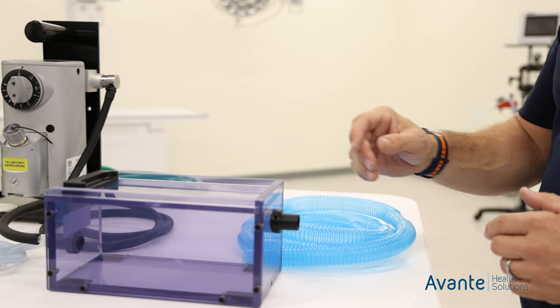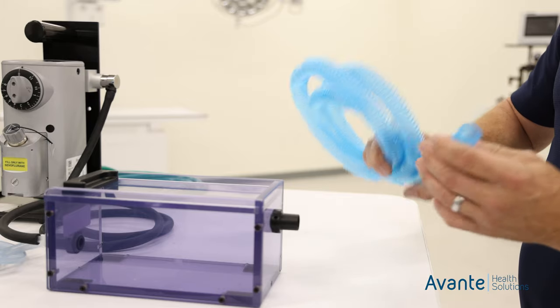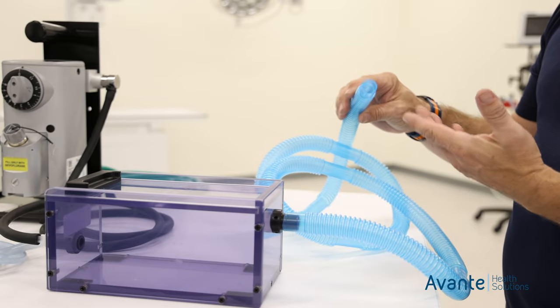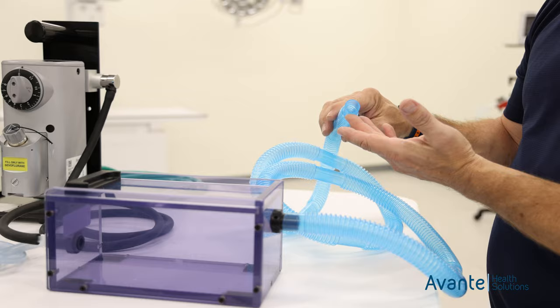For the scavenging portion of our induction chamber, you're going to use the 19 millimeter tubing that's provided. It simply slides over the exhaust port, and this end will either go to a scavenger interface or to your passive scavenging system.